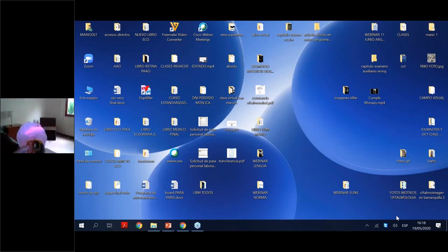It's like a clock. Then this is the transversal scan. I can also do a longitudinal scan. Look, the upper part of the scan is anterior, and the most inferior is posterior. And this is the difference between a transversal scan, where I can go from 9 to 3, and a longitudinal scan. This is only one hour.